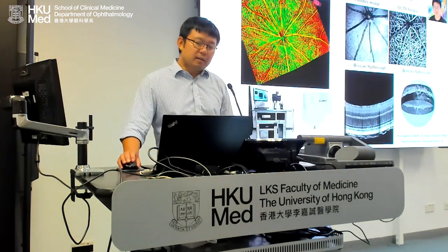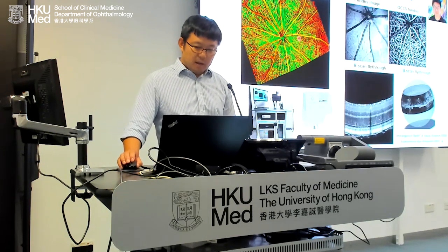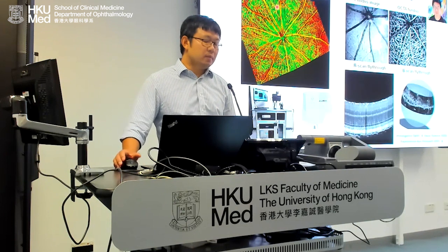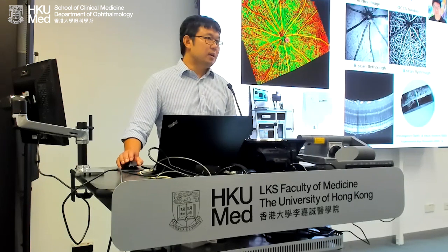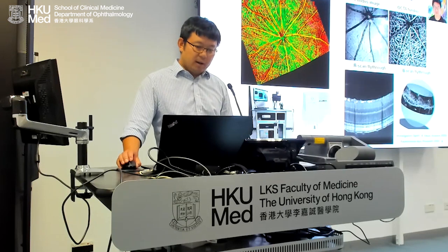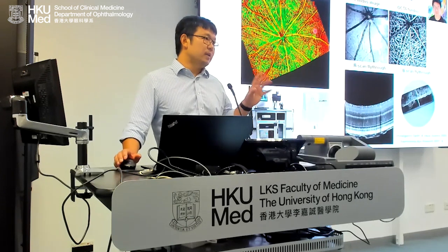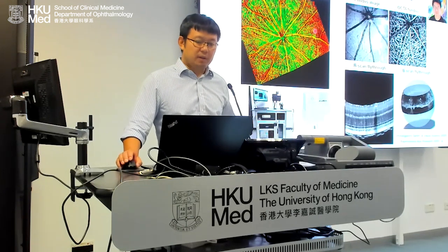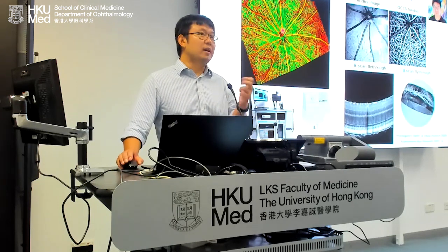And this is the latest iteration of visible-light OCT and visible-light OCT angiogram. I will show a few cases of how we did it. What you see here, the green colors are actually ganglion fiber bundles in mouse eyes, and the red colors are the capillary network. They're all scanned by the same protocol from the same volume, just processed differently. And because of the high contrast and high resolution, we're able to visualize that.